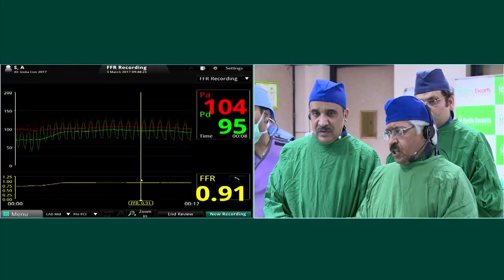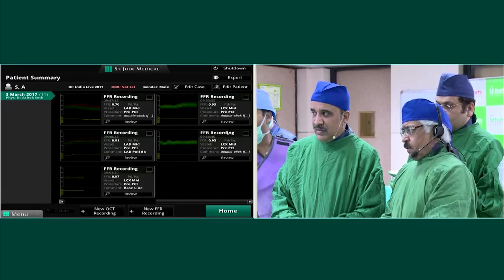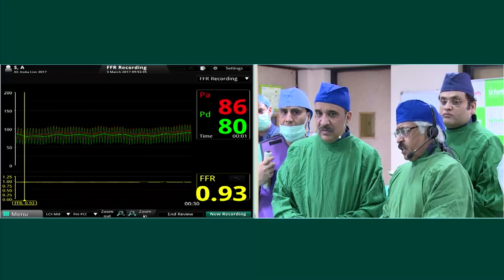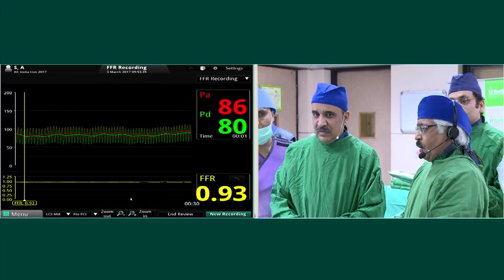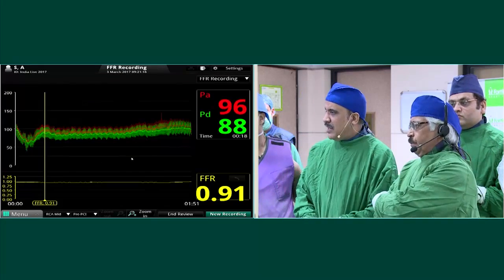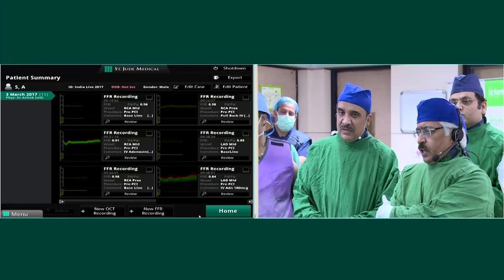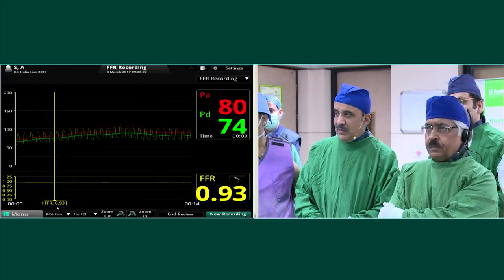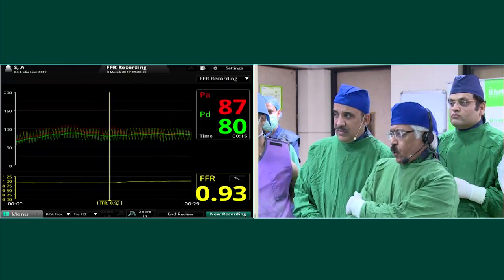But the third point is the circumflex. Can we just show them the circumflex FFR? And I would like you to comment on it. Twice measured, twice done, the circumflex FFR was 0.93. The RCA FFR was 0.91. We measured the gradient both at the lesion as well as the ostia of the RCA, 4 millimeters of gradient at each point. The circumflex was not a pullback.